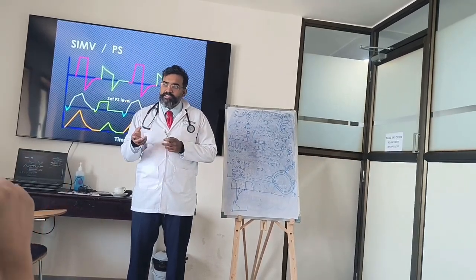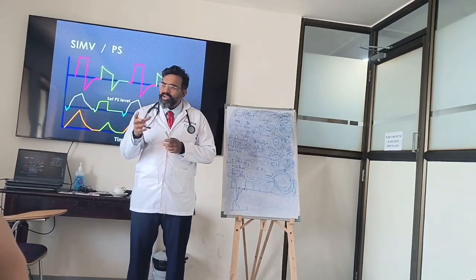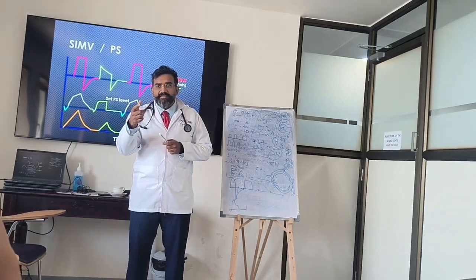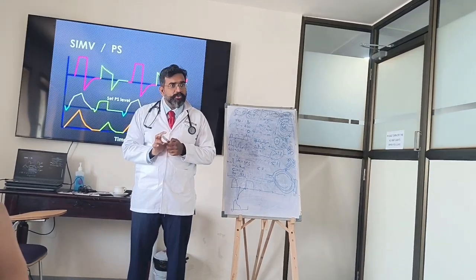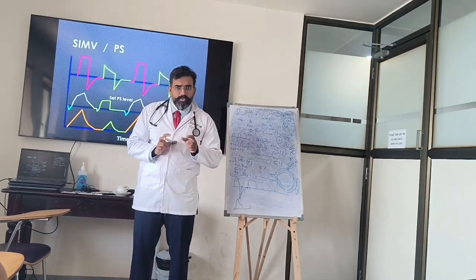Here what is happening? There is an SIMV window. Okay, the SIMV window will not allow you to take that extra breath there. Clear? Do you understand? It will not get supported also. Nothing will happen. It will not allow only. That's called the SIMV window. Do you understand?